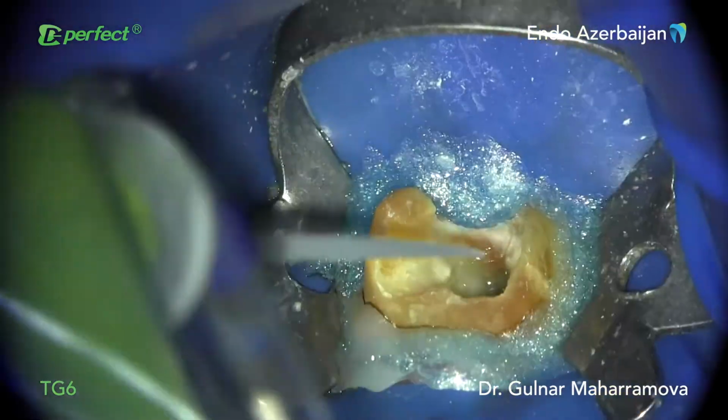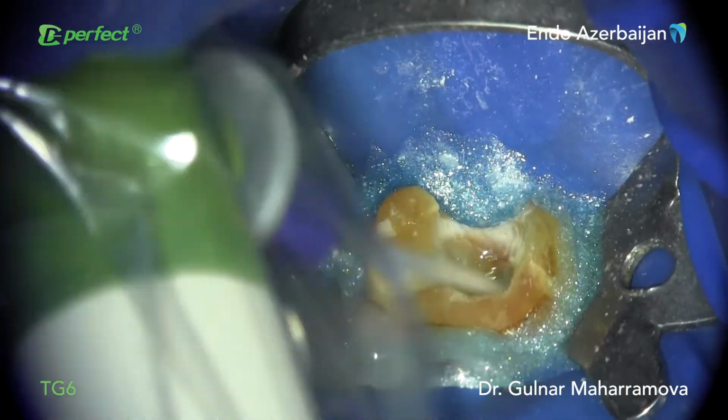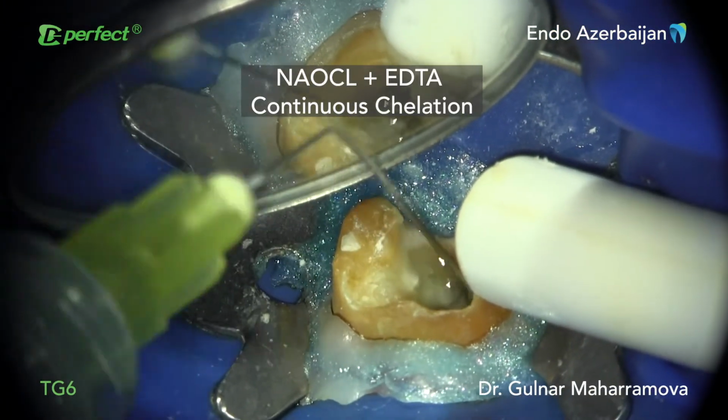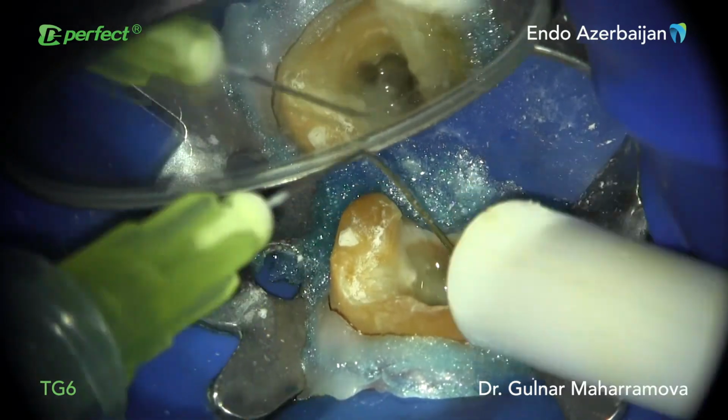To obtain a better cleaning, I use sonic activation during a final irrigation. Moreover, the principle of continuous chelation by mixing 5.25% sodium hypochlorite and 17% EDTA solution was applied to get the effective disinfection of a complex anatomy.